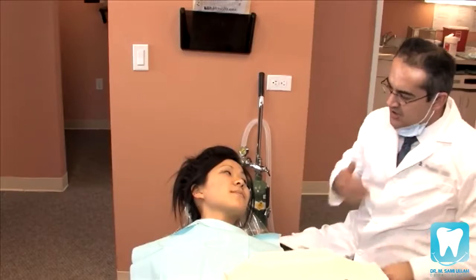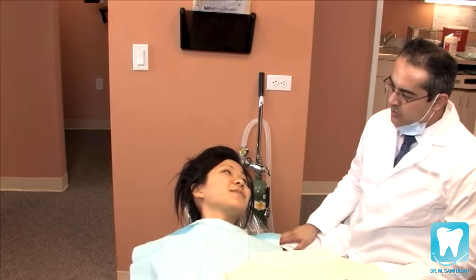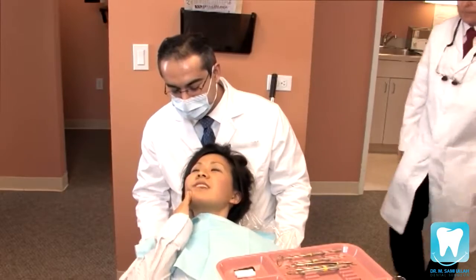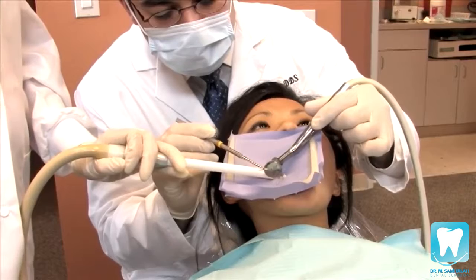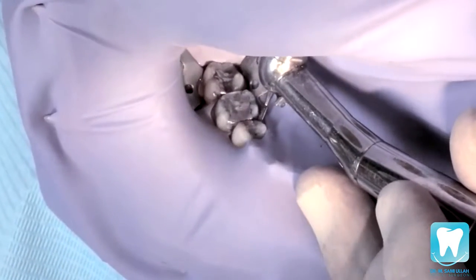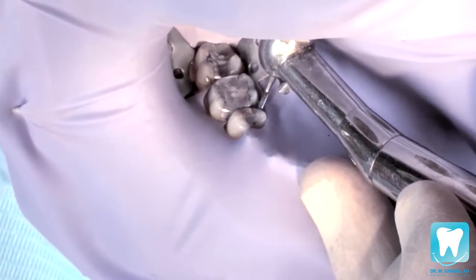After your dentist detects a cavity, either through a clinical exam or with the use of x-rays, it's time to actually fill it. In most cases, a local anesthetic is used to make the filling procedure virtually painless. Once the tooth is numb, the next step is to remove the tooth decay. This is done using a dental rotary machine, as well as dental hand instruments. Once the decay has been removed, the tooth is now ready for the filling material of choice.